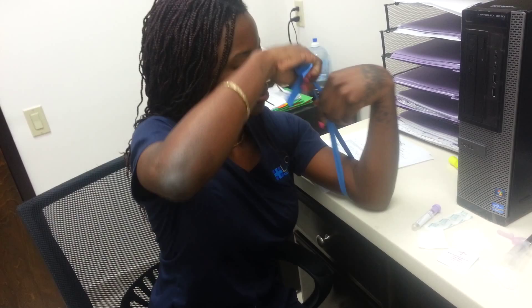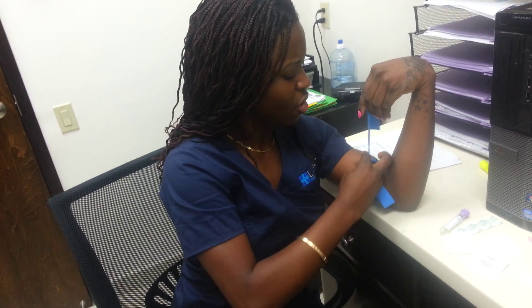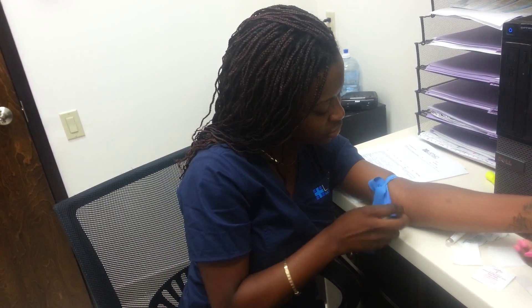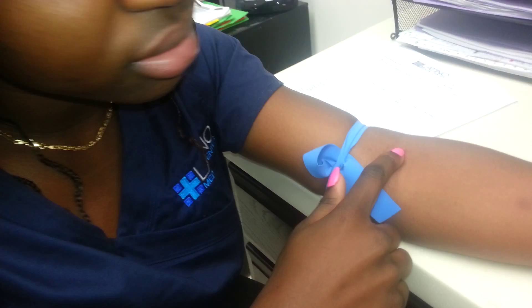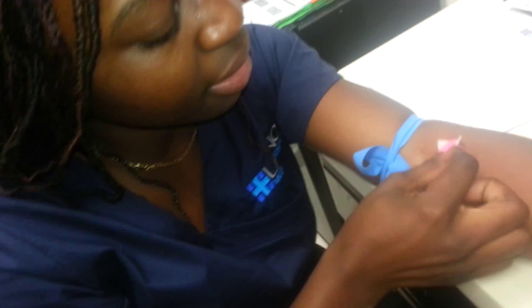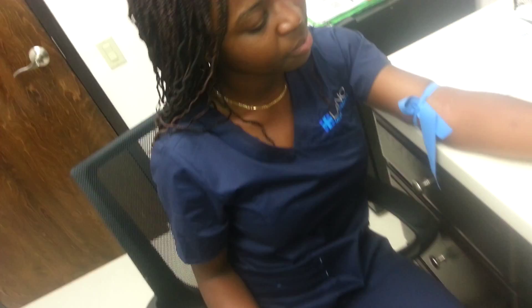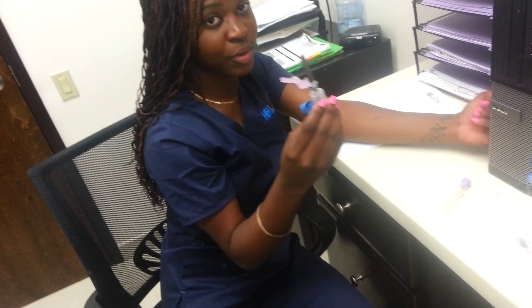Let's see how this goes down. I know it will be successful — it has to be. Look for a good vein. We'll come in close up a little bit. See this vein right there? I'm going to wipe it one time to get rid of the bacteria. I'm going to let it dry. I'm going to take the needle.